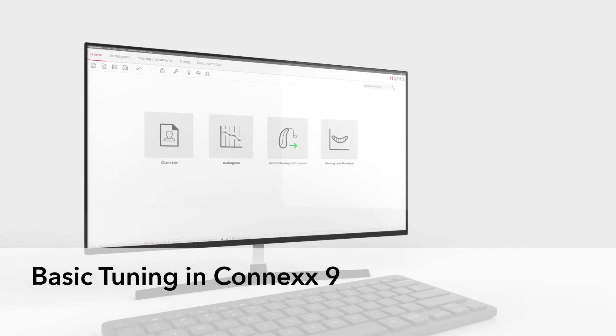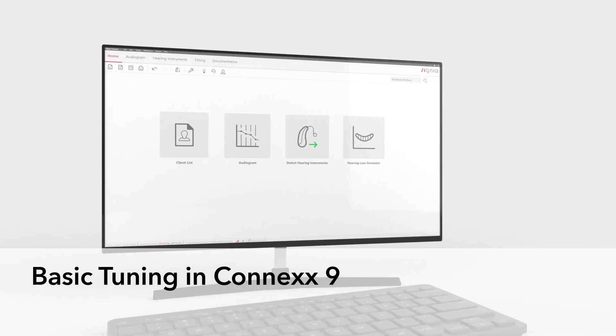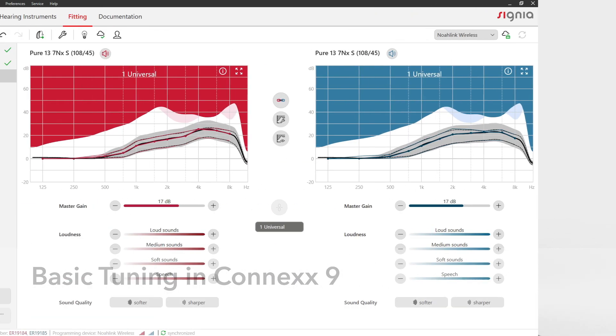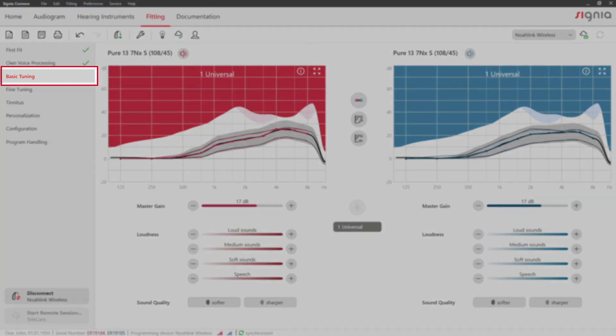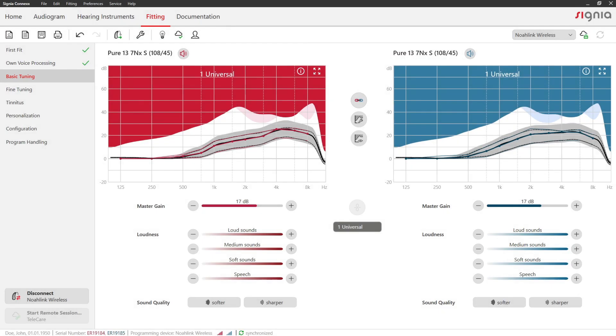Basic tuning in Connex 9. Enter the basic tuning page, where you can quickly modify basic settings.